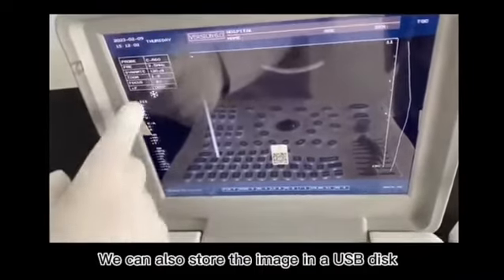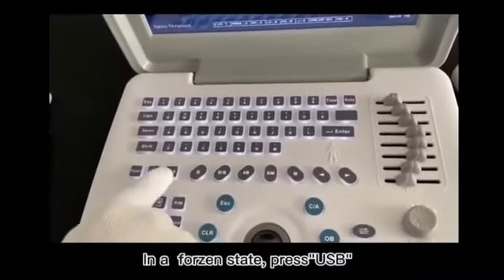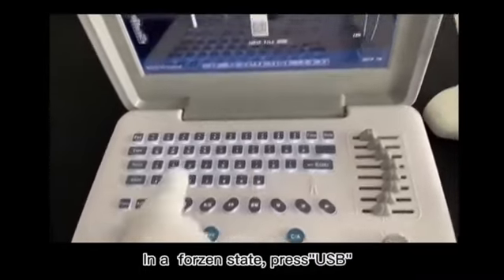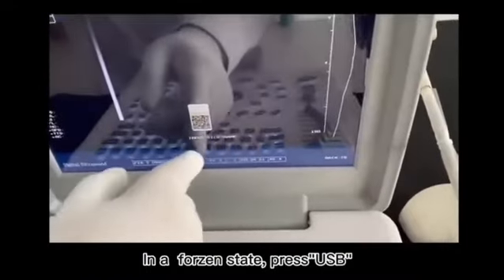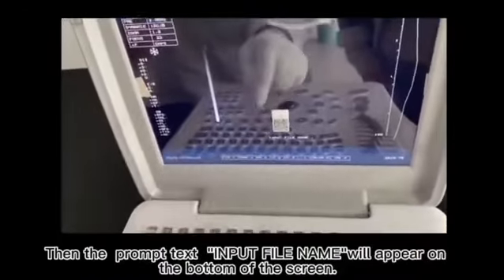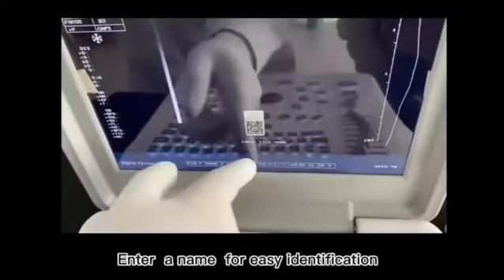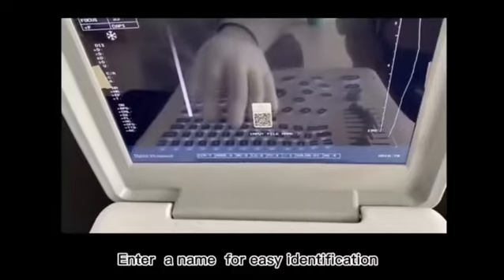We can also store the image in a USB disk. In a frozen state, press USB. Then the prompt text input file name will appear on the bottom of the screen. Enter a name for easy identification.